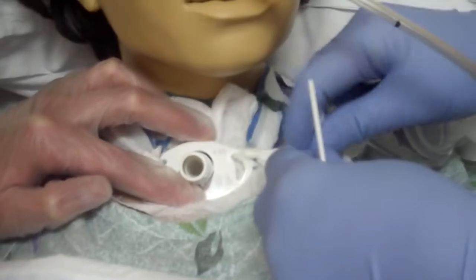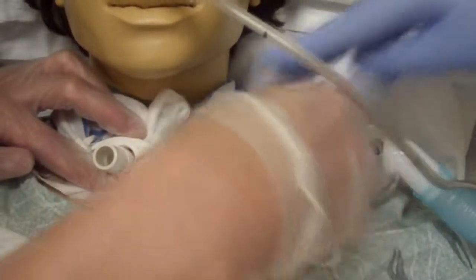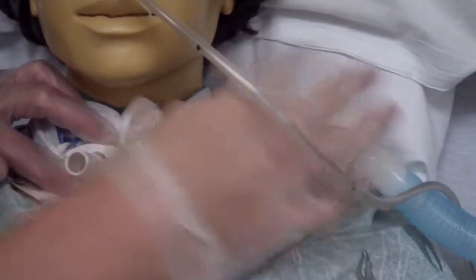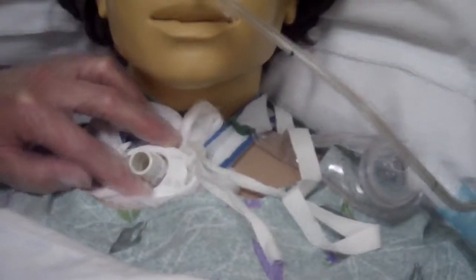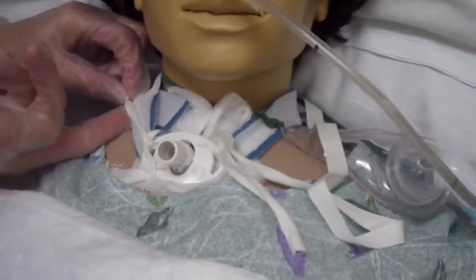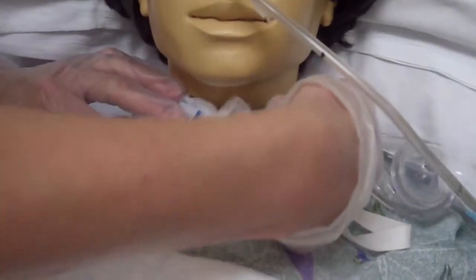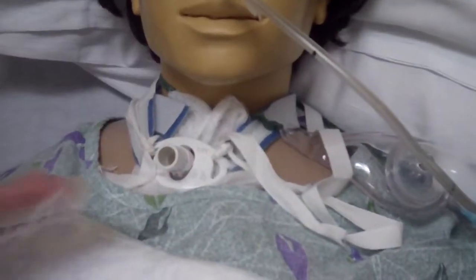And then when she's done with that, we're going to pull the excess over here, cut it, tie it into a bow along the neck as for easy removal if necessary. And then we're going to check the fit of the collar, placing 1 finger under each side and making sure that it fits with the 1 finger underneath and is not too tight or too loose.